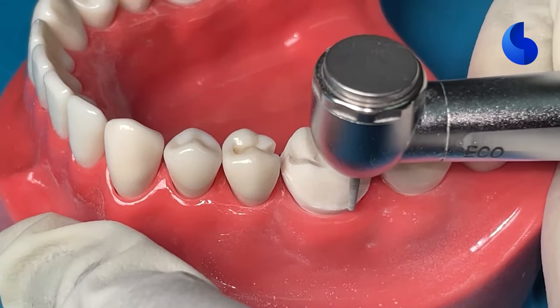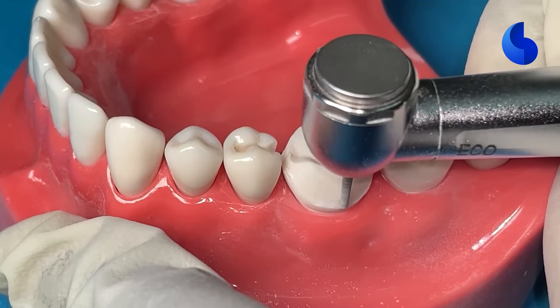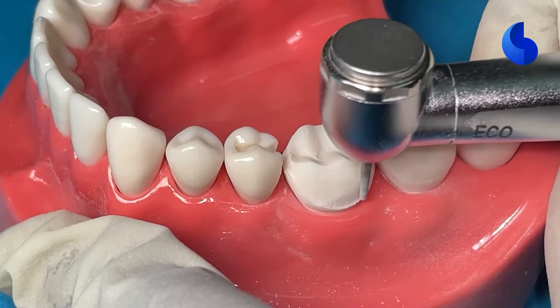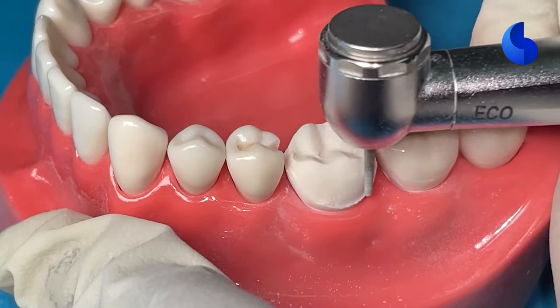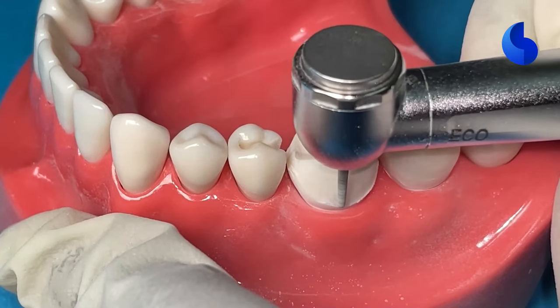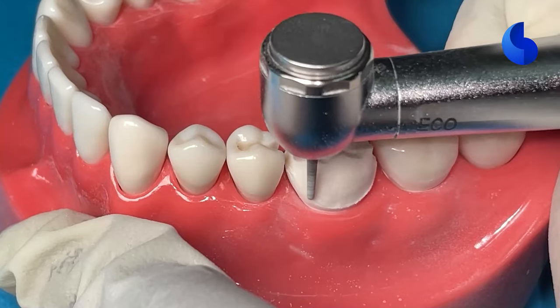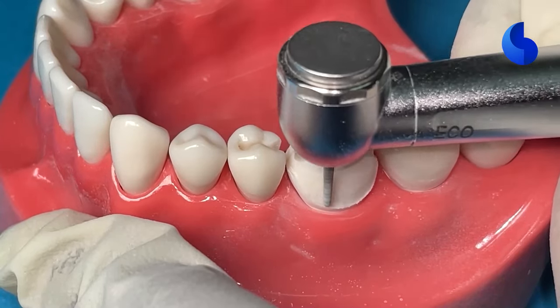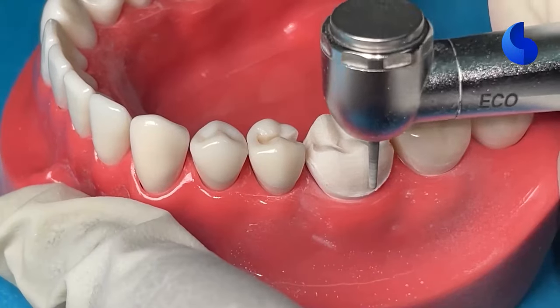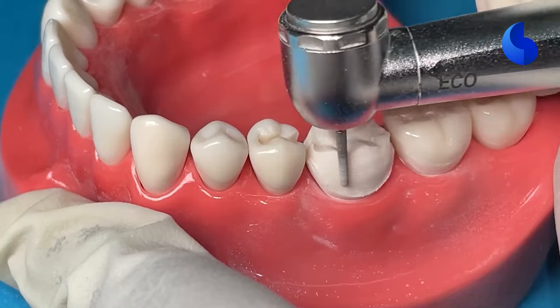So you can start with a surface that you're confident with, for example, the buccal surface, and start refining your margin and start placing it at about 0.5 millimeters from your gingival margin. As you can see, we had some wiggle room and now we are slowly taking that margin a little bit gingival so that we achieve that ideal 0.5 millimeter distance from the gingival margin.